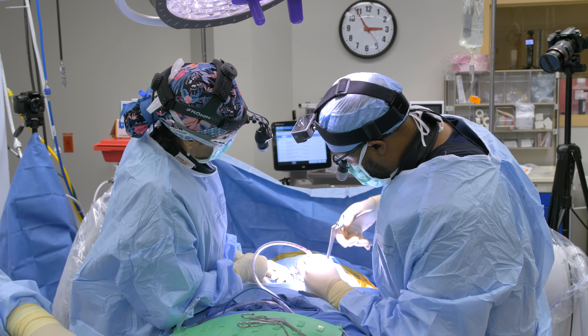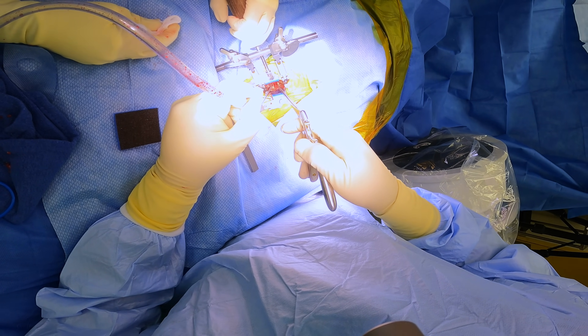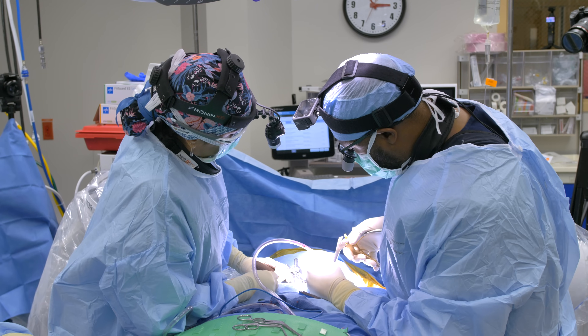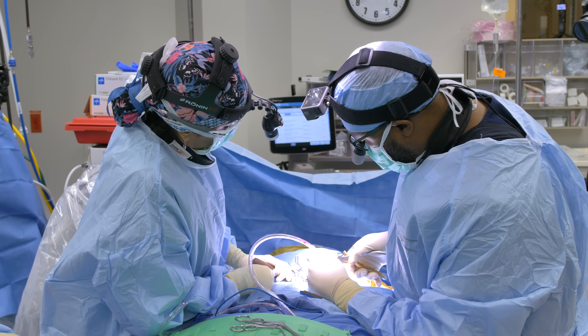This is the spinal cord right here — this bluish structure. This is the PLL, and I have my hook of my Kerrison right under the PLL. I'm just biting it, removing that ligament, so I can effectively decompress the spinal cord.